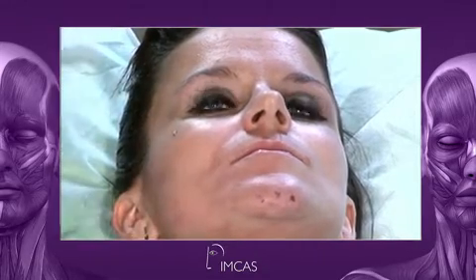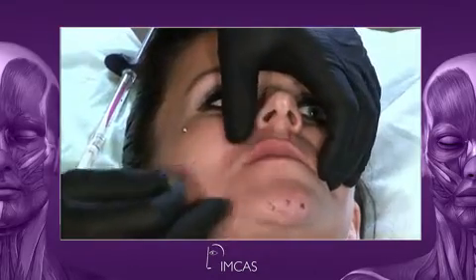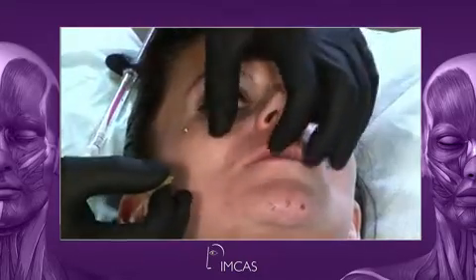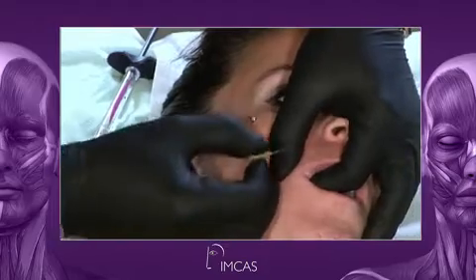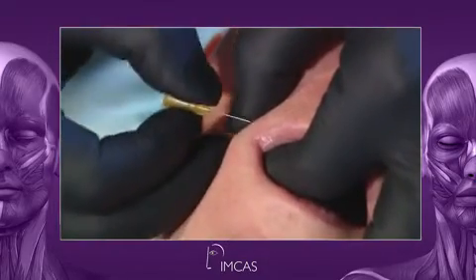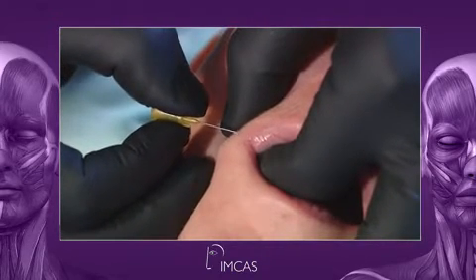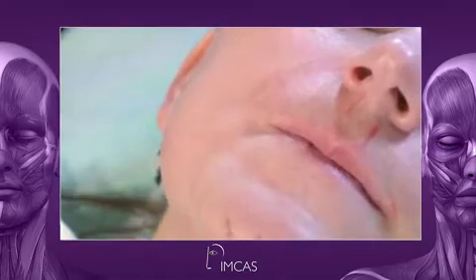So what we have for considerations here, we looked at it previously a little bit. We need to create eversion in the upper lip. We have a high risk of creating too much projection and ending up with hashtag duck lips otherwise. We also always have a small vein running quite close to the corner of the mouth, so we want to avoid that when we do our entry point. So it's just through the skin, we don't need to go any deeper.